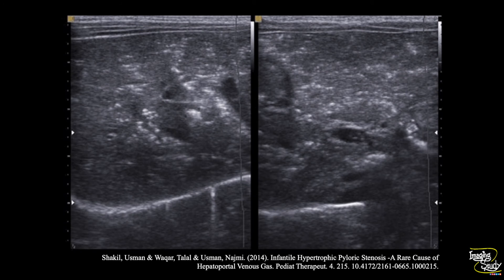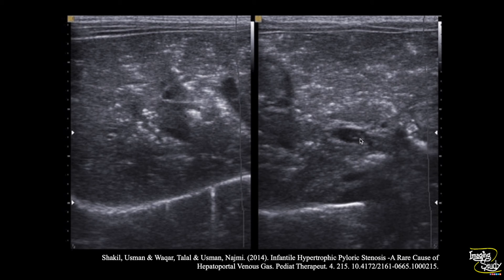This is a patient diagnosed with infantile hypertrophic pyloric stenosis, which is a rare cause of hepatoportal venous gas. On ultrasound you can see echogenic patches within the liver parenchyma indicating parenchymal gas, and echogenic foci are also seen within the portal venous lumen.